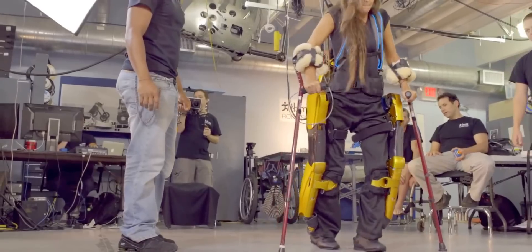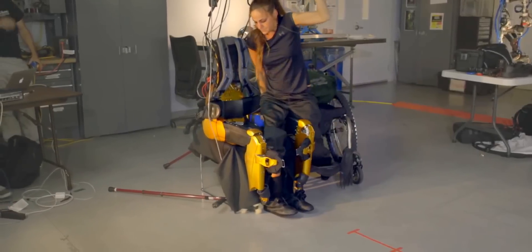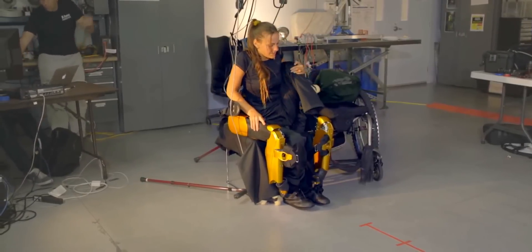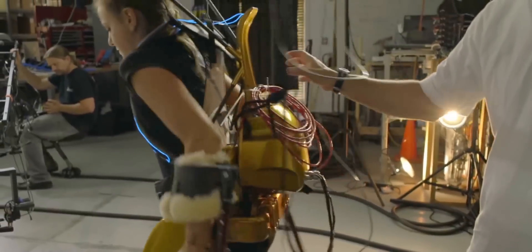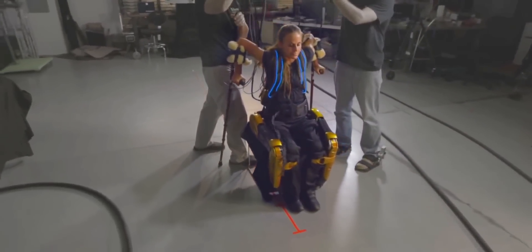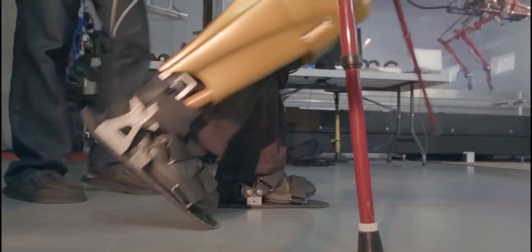The X1 has some key advantages. We designed special cuffs at the shin which enabled the user to transfer from a wheelchair into the X1 in a seated position. We also tested sit-to-stand and stand-to-sit transfers from the exoskeleton. The X1 has more capabilities in terms of torque and speed.